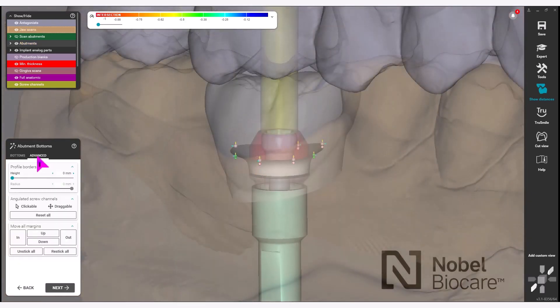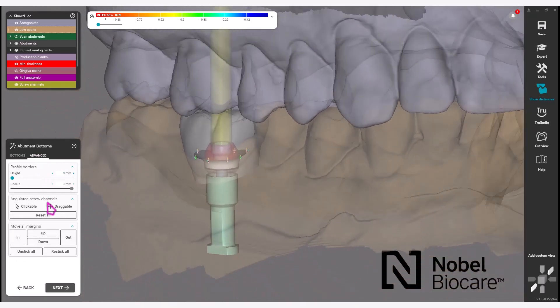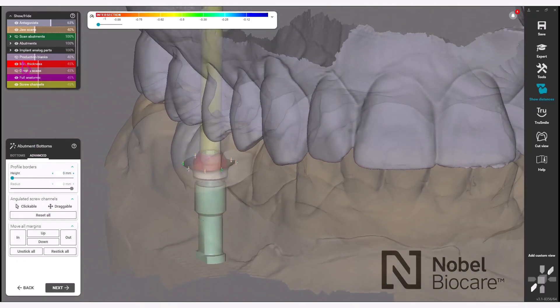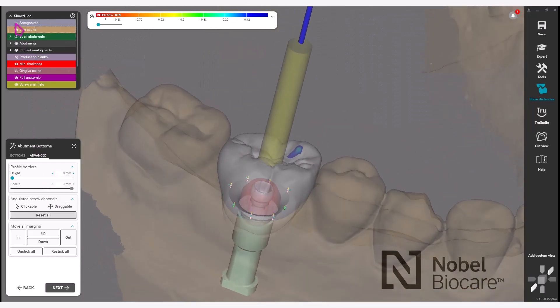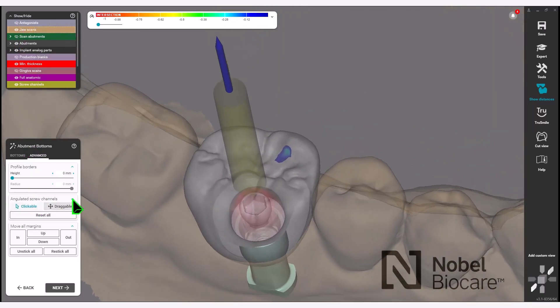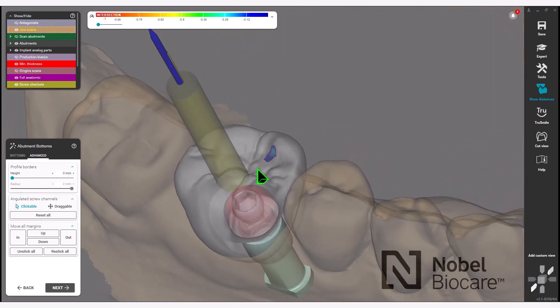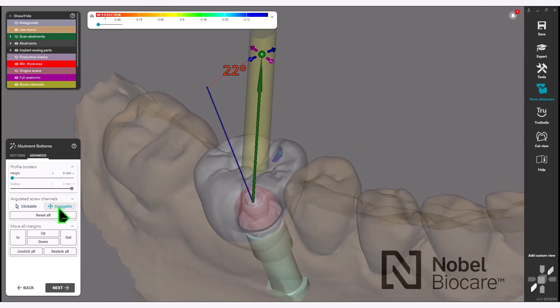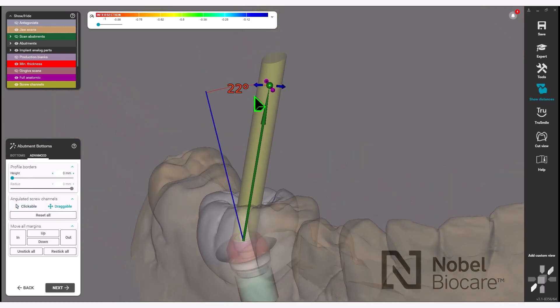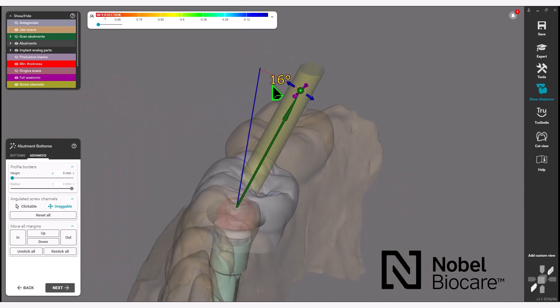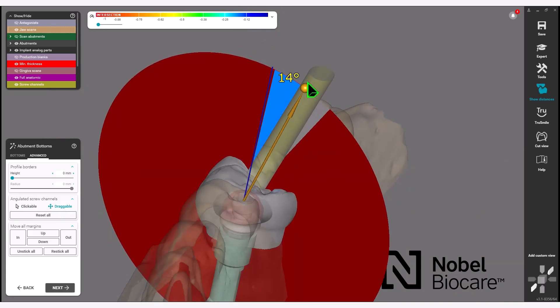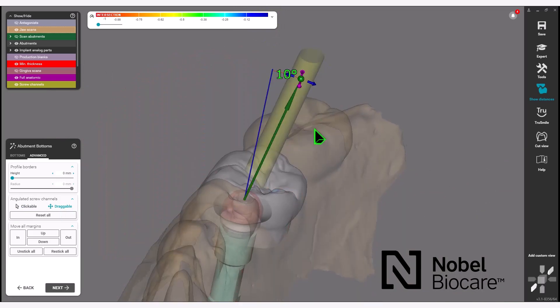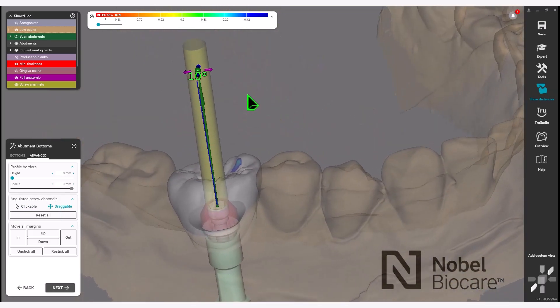Under the advanced section, you will see angulated screw channels. If you are utilizing the angulated screw channel, you have two options: Clickable, which allows you to select anywhere on the surface of the crown, or Draggable, which gives you an indication and angular measurement for exactly setting your angulated screw channel position.